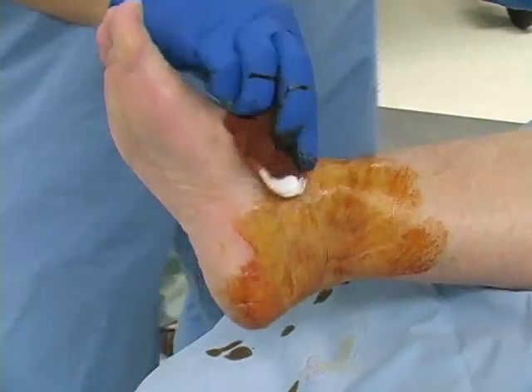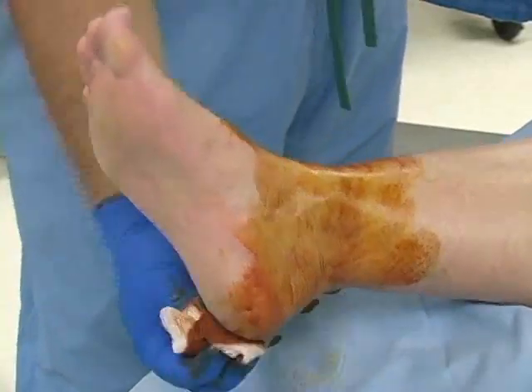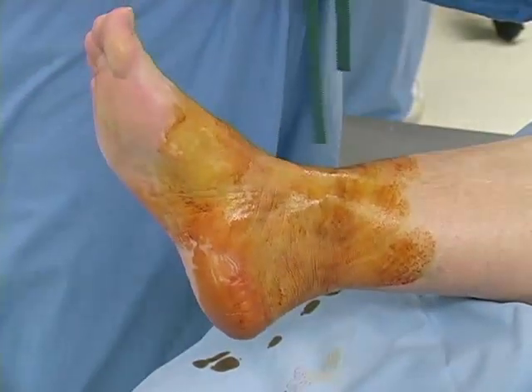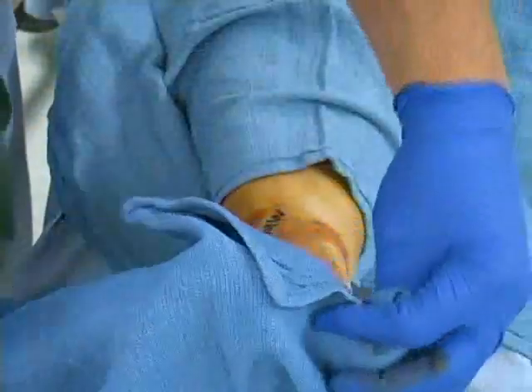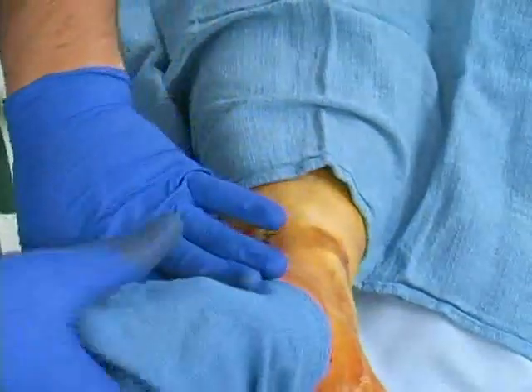After the foot is correctly positioned, use a betadine prep to cleanse the foot. Start above the ankle and proceed to clean the foot and toes. Carefully cover the calf and foot with sterile towels, leaving only the ankle exposed. Allow the betadine solution to dry prior to needle insertion.